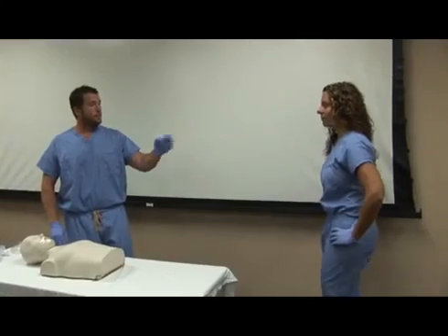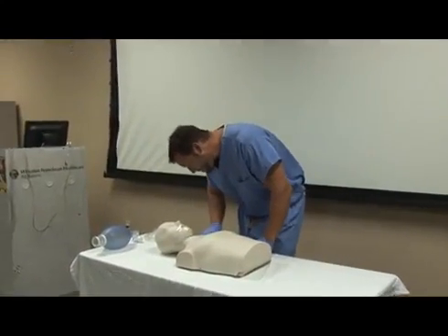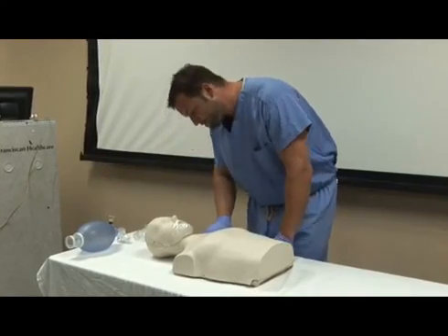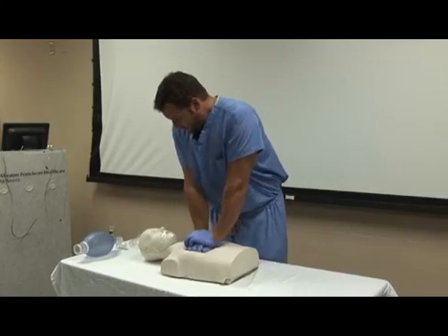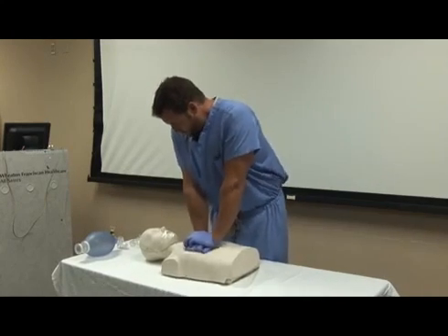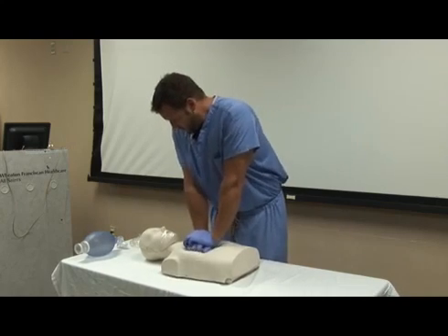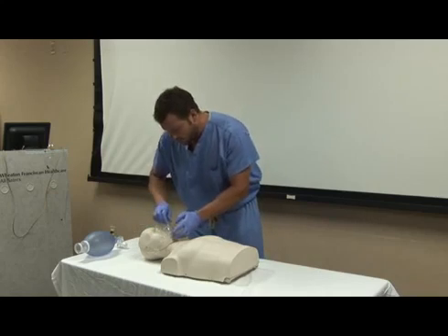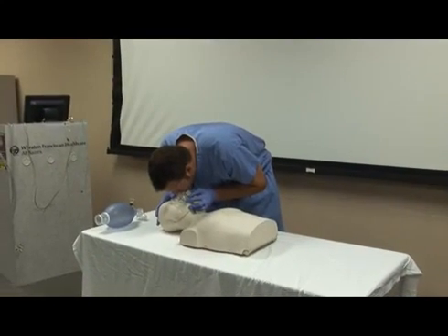Step two is to activate the emergency response system and get an AED. Step three is circulation — check for a pulse. If you do not feel a pulse within 10 seconds, start CPR. Immediately start giving cycles of 30 chest compressions followed by two ventilations. The key concepts here are to push hard and fast: hard meaning at least two inches, and fast meaning at a rate of at least 100 compressions per minute.